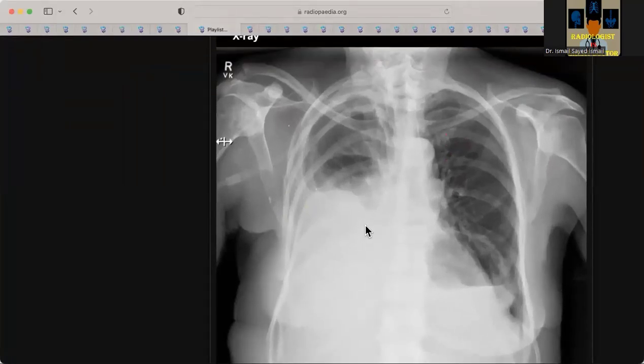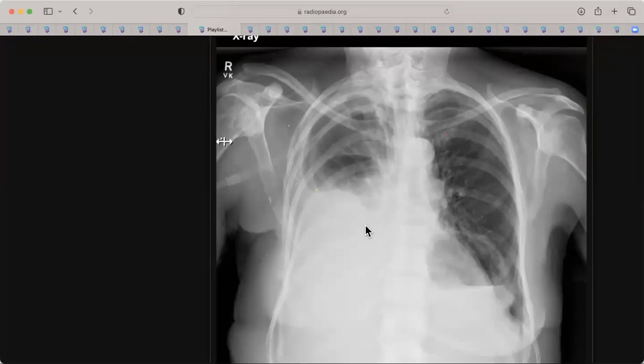So who's next? This is an elderly female who presented with cough. Is it candidate 5 or 6? Should be 6. Candidate 6, are you there? If not, candidate 7. Hello? Yes, hi, we can hear you. Do you want to go? I am candidate number 7. Yeah, go ahead.